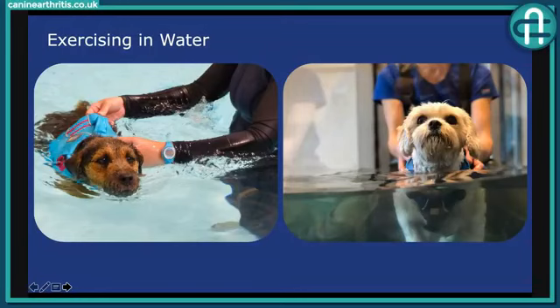Now, the difference between those is that swimming is an open kinetic chain activity or exercise, which means that the body part away from the trunk is free during movement. So the legs are free during their movement, and at no point are they in contact with a surface. So there's no proprioceptive endpoint. To improve proprioception, in a functional way, you need to have your foot in contact with the surface. For example, balancing on one leg, or your physiotherapist has asked you to do a 3-legged stand with your pet, by drawing one leg away from the surface and getting them to maintain their core and dynamic stability and their balance through the remaining limbs as well.